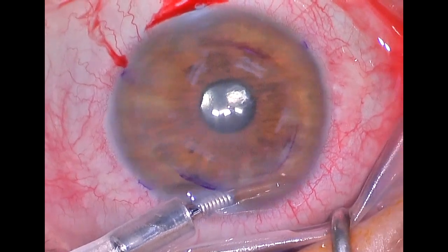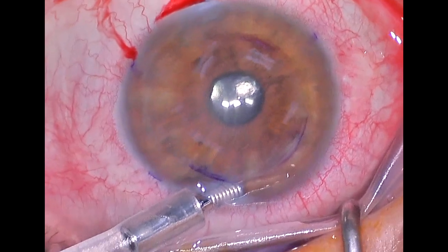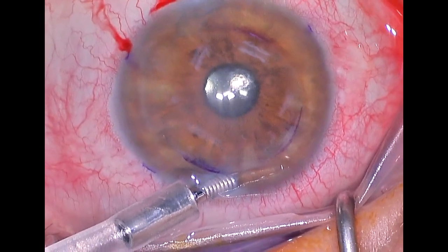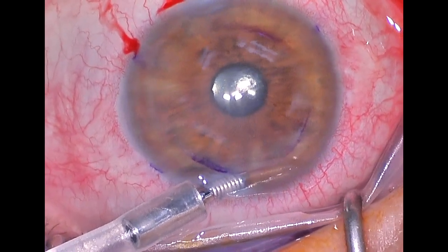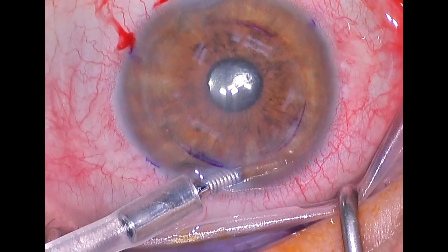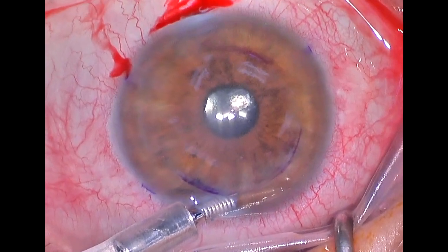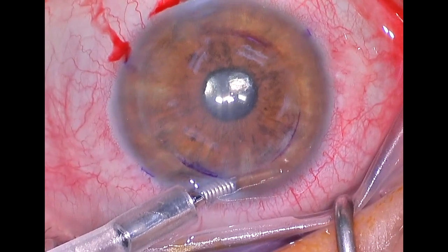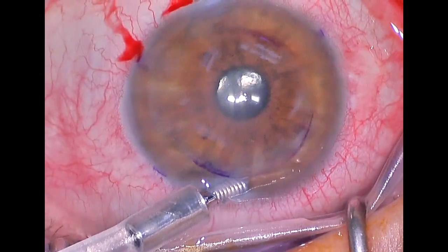We prepare the graft off camera, and when we inject it, it's injected as a scroll of tissue similar to the one we removed, except the scroll of tissue in this case will be stained dark blue so that it can be more easily seen. It will also be a smaller, tighter scroll, which sometimes can be difficult to unroll.